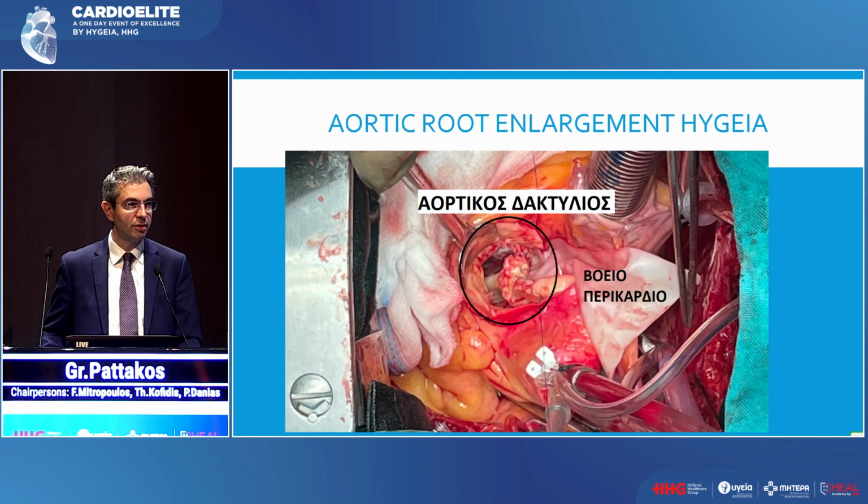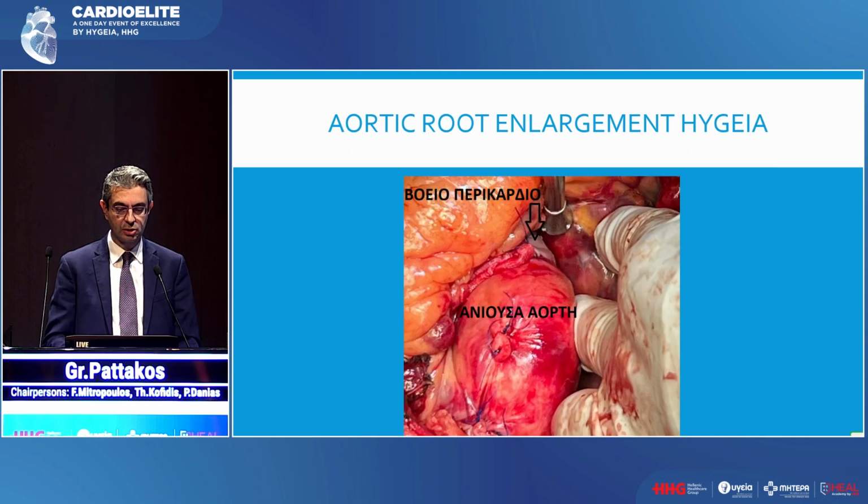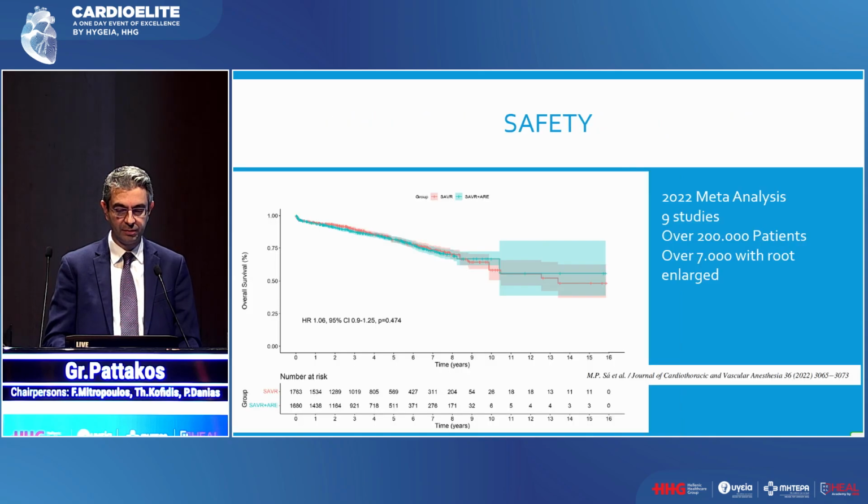This is our version of the case. I don't have a video, but photos that I think Dr. Spiridakis, our anesthesiologist here, may have taken. So this is the aortic root. You see the bovine pericardium being sutured to the aortic root, and you can usually get a valve that's 2 sizes larger in. And you see here how we use the bovine pericardium in order to close the aortotomy.